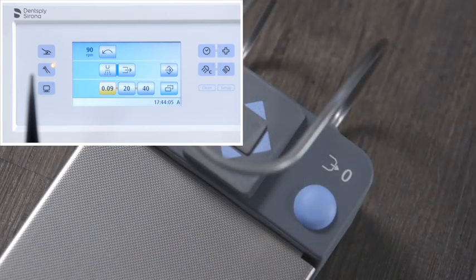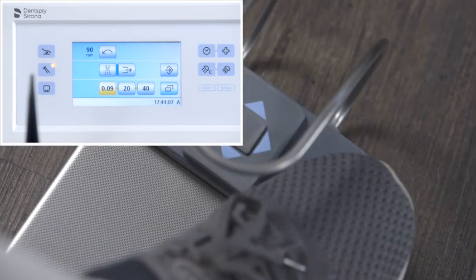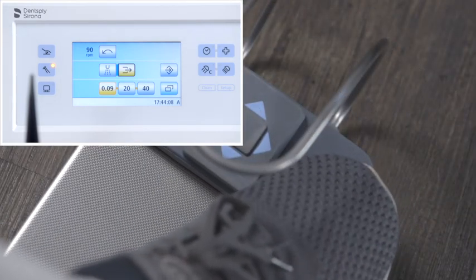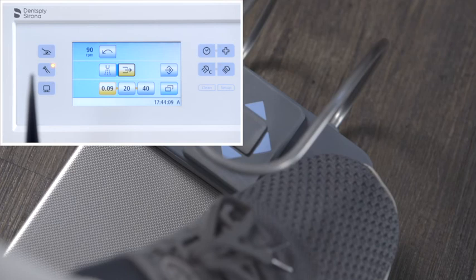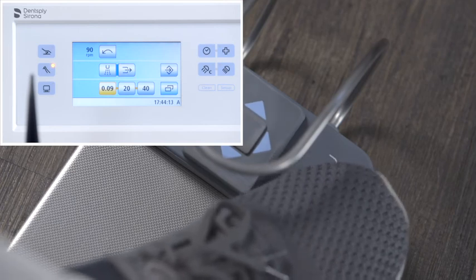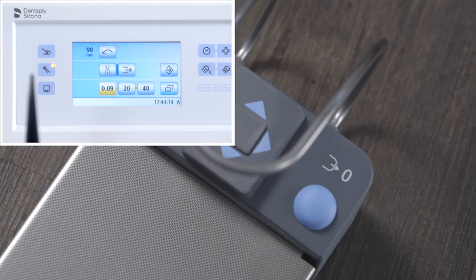When an instrument, for instance motor or turbine, is taken from the holder and the right button is pressed, the chip blower is activated for as long as the button is pressed.